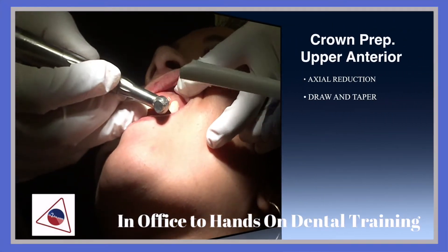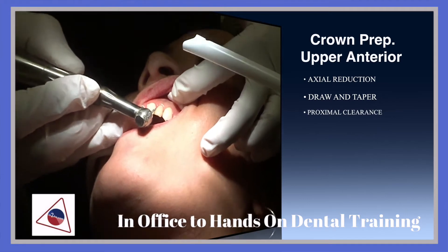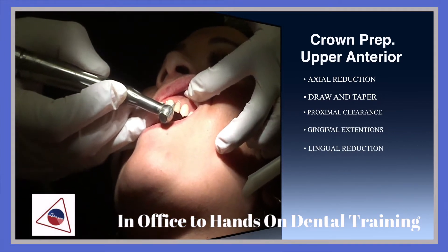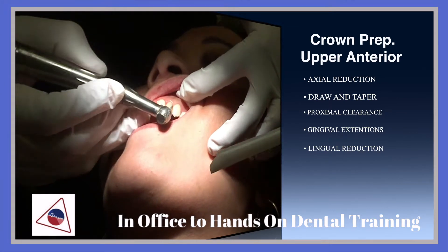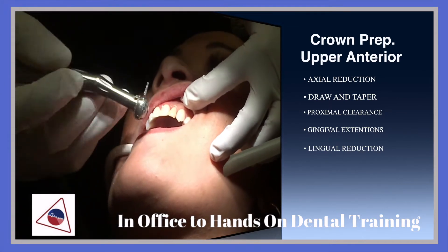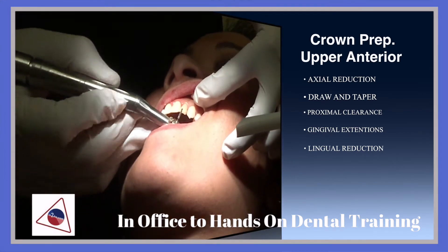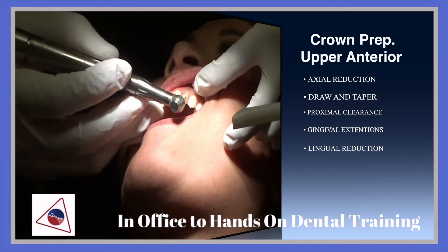So she's got this tooth. I could either start right here to break the contact on the distal or the mesial, or do the reduction on the incisal edges of the tooth.